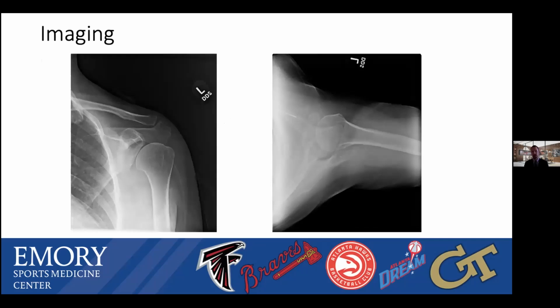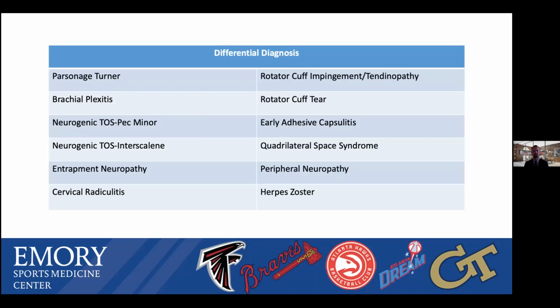So we had obtained plain films prior to her coming in, and they didn't contribute to her case specifically. There was no acute injury, no fracture, no dislocation, no significant degenerative changes that would explain her presentation.